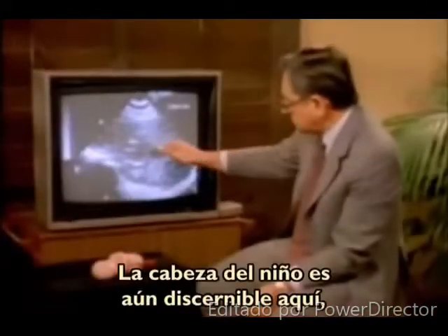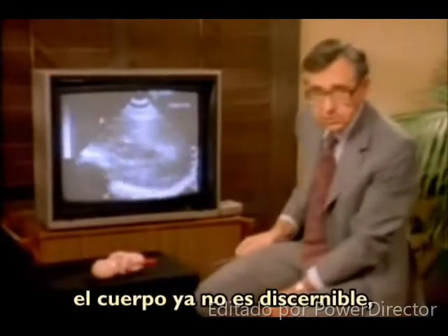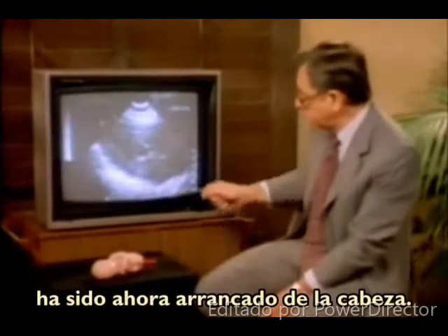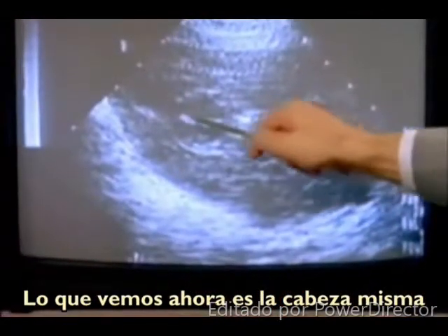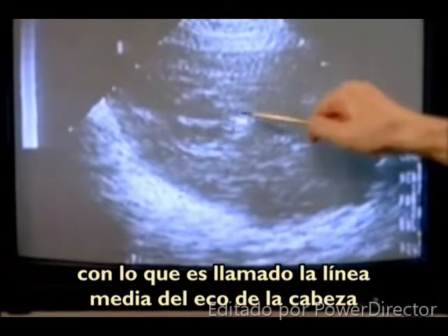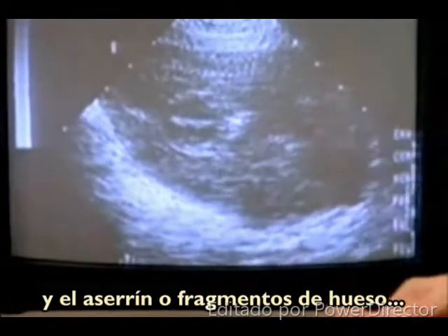The child's head is still discernible here. The body is no longer discernible. It has now been torn from the head. What we see now is the head itself with what is called the midline echo of the head and the spicules or fragments of bone.